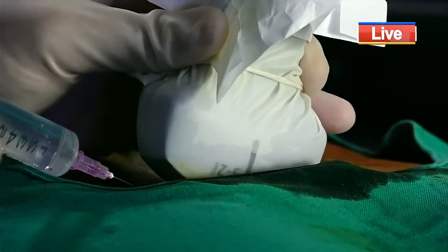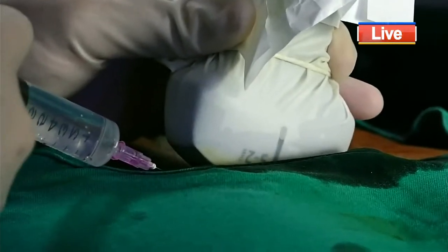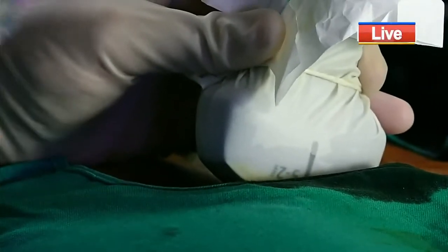Okay. So you have to ask the patient when she is comfortable and give the local probably in the direction where you want your needle to be, but anesthetizing just the skin and subcutaneous tissue is usually more than enough.